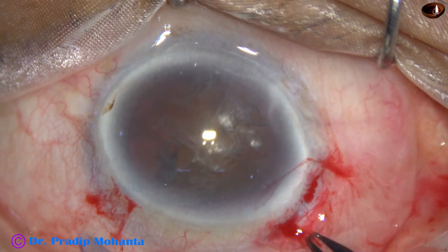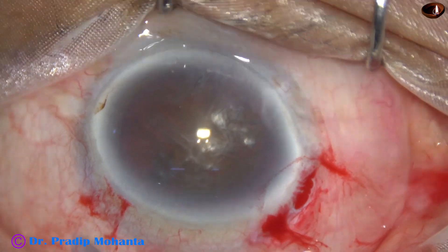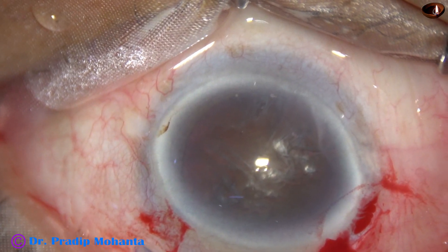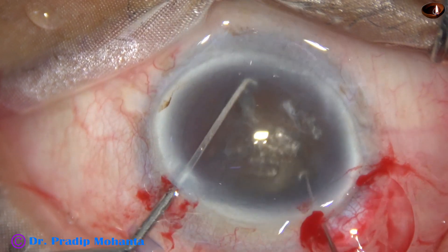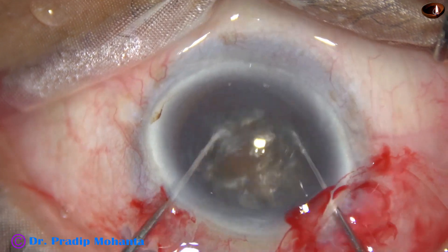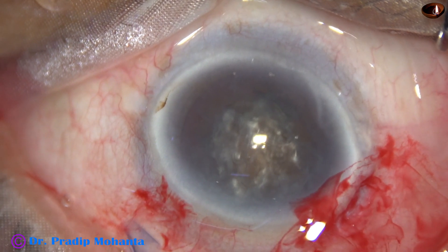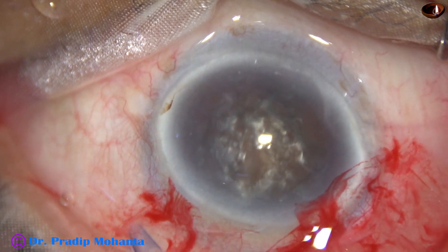A very hard nucleus. And if we try to rotate it with one instrument, there can be stress on the zonule. But bimanual rotation is very friendly to the zonule. So the nucleus rotation is nice.